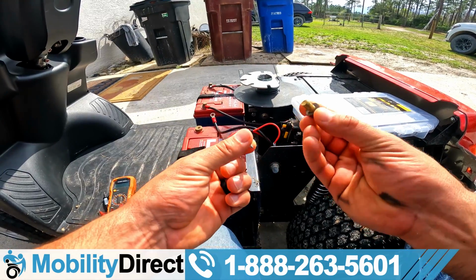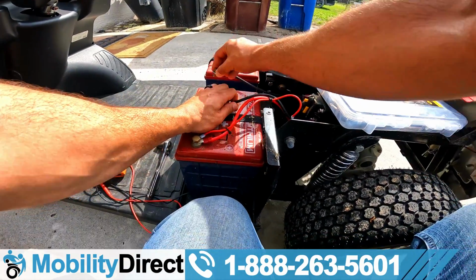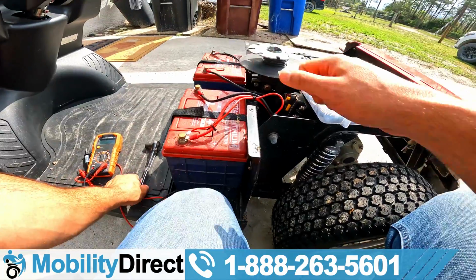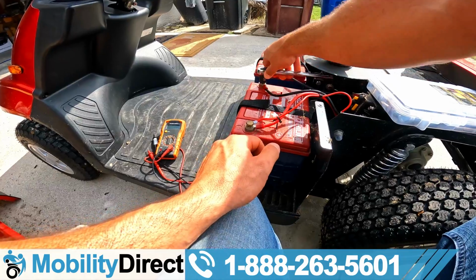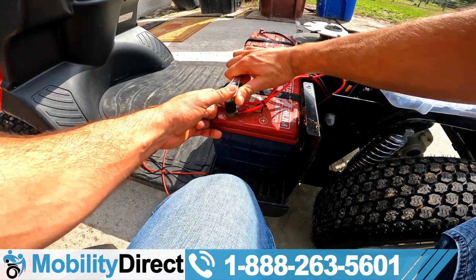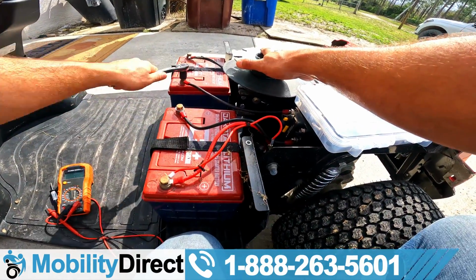So what I'm doing is I'm putting an extra washer in here. That was the problem. These bolts are not the original bolts that the unit comes with. So I'm gonna have to modify it a little bit and improvise. That's okay. It's just a washer. We just wanna make sure that that bolt is nice and tight and that it's not wiggling around, because this is an off-road scooter. So when it's shaking around like that, guess what? It could lose the connection just enough so that the voltage goes below what it requires to actually operate the unit, which again, 24 volts is the minimum.